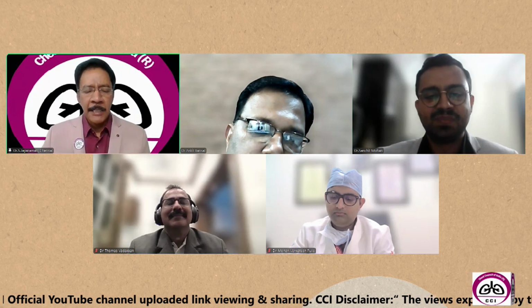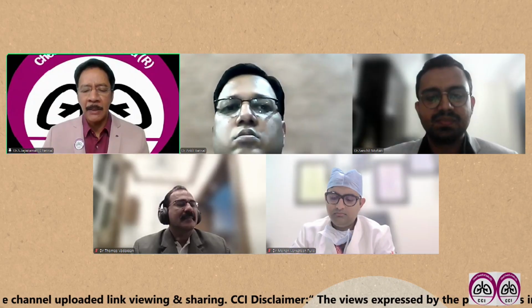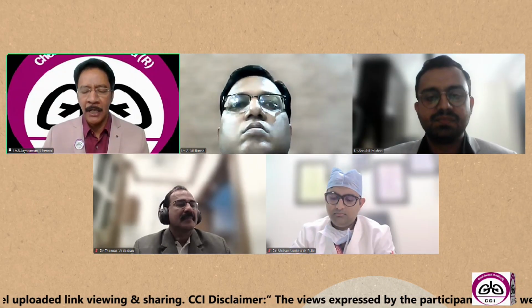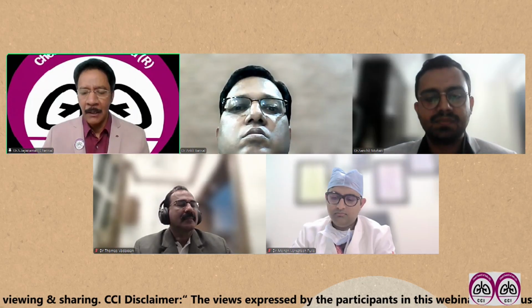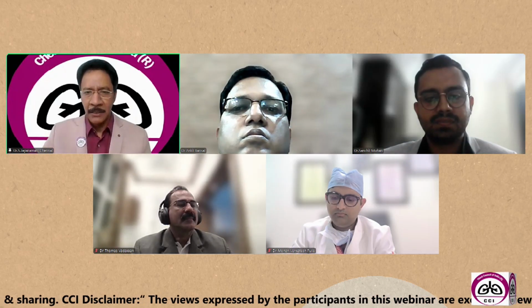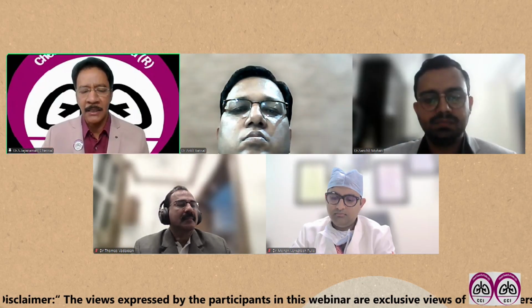Yes. Fantastic answer for approaching the 5 and 6, that is the para-aortic and sub-aortic nodes, through the EBUS. Yes, we can take them through the transvascular needle aspiration, or through the EUS, through the esophagus, we can approach the 5 and 6 lymph nodes.